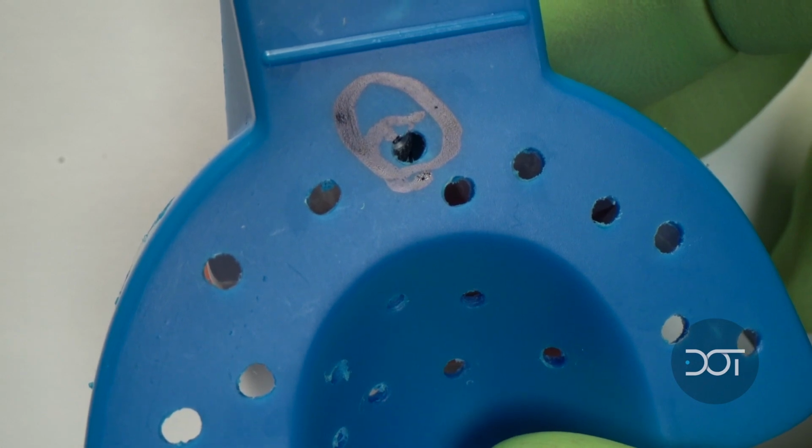So I do it just like that, and then I go into the laboratory and I'm going to open up that area so that I can place my impression and that screw will be coming through that hole that I just created. After we've created that hole, we want to try it in the patient's mouth.